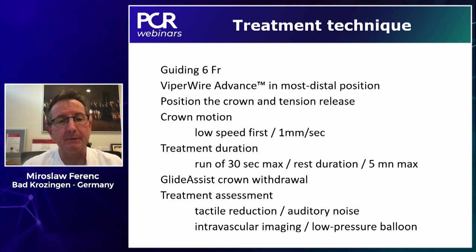And after the orbital atherectomy approach, it's really easy to go forward with a balloon. We usually go with 10, 12, 14 atmospheres, and we see what will happen. Sometimes in some cases, on top, you can also use a shockwave balloon to prepare the lesion more adequately. But definitely for that, you will have a very nice channel. So this is, from my point of view, the most important points to approach and use this system. It is really safe and doing a really great job.